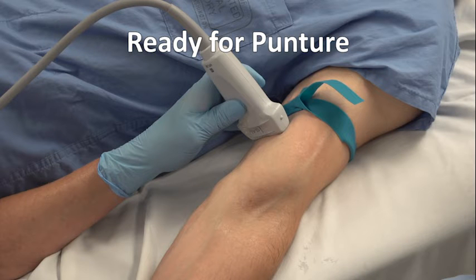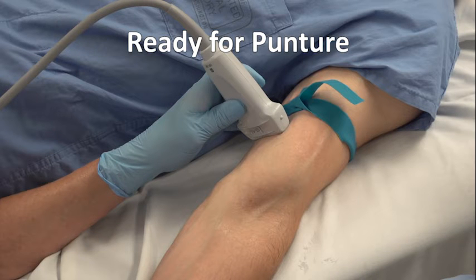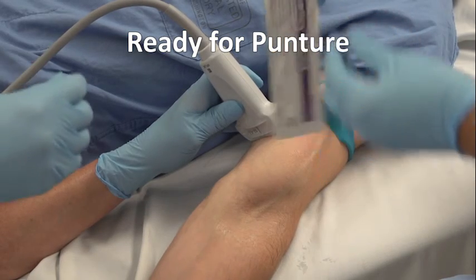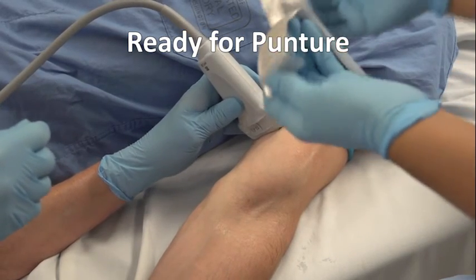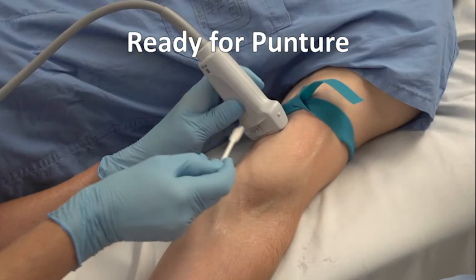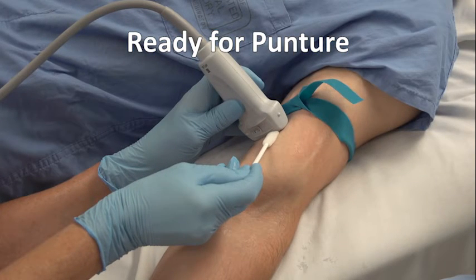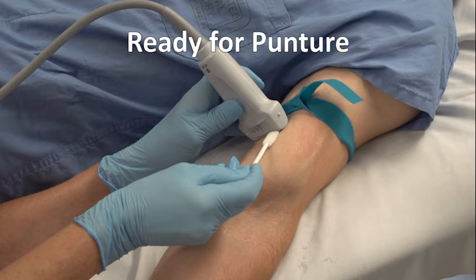Now you are ready for puncture. First, clean the skin using chlorhexidine — do not use alcohol as this will degrade the probe's surface. Have all your equipment nearby. Some patients may require a small dose of local anesthesia prior to puncture.